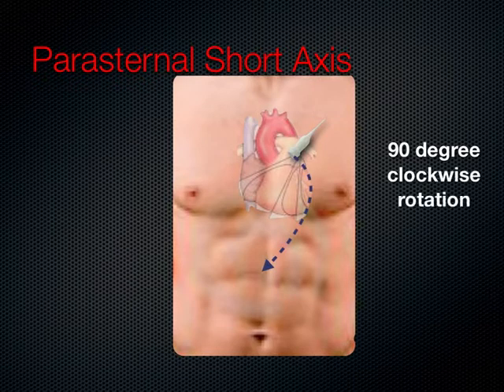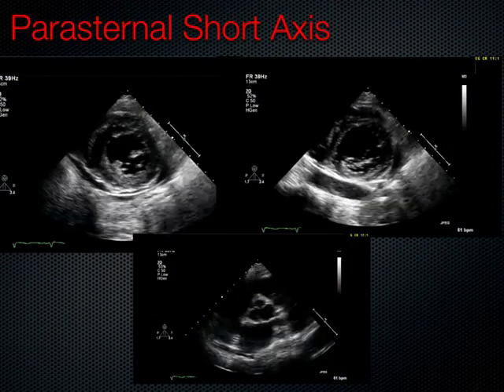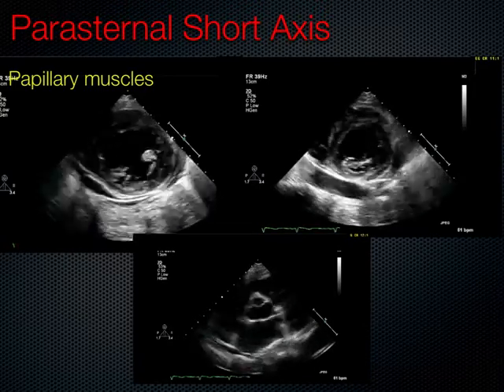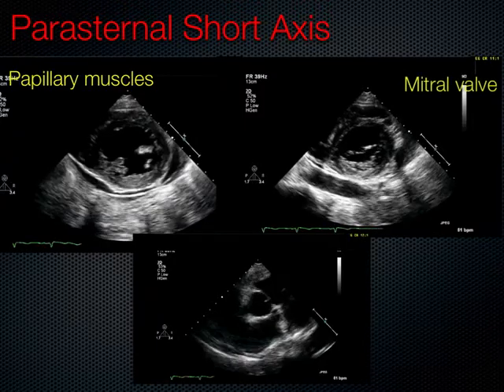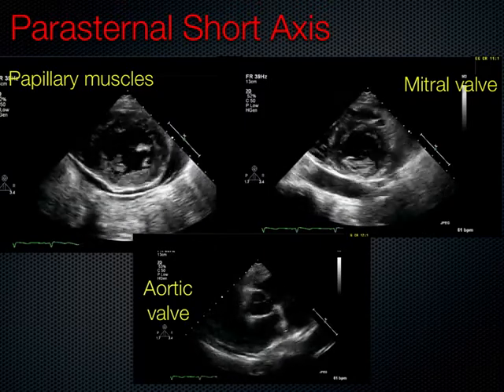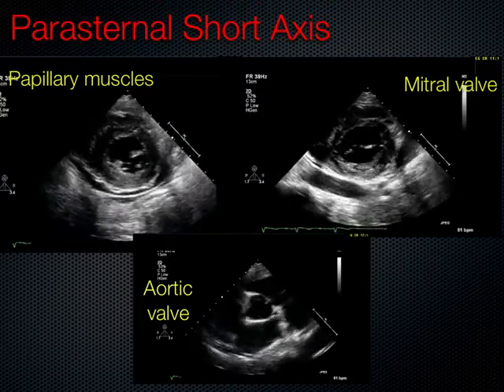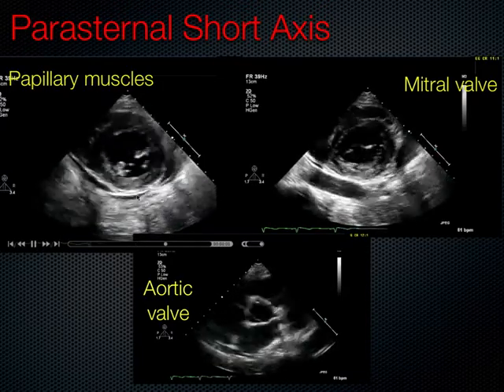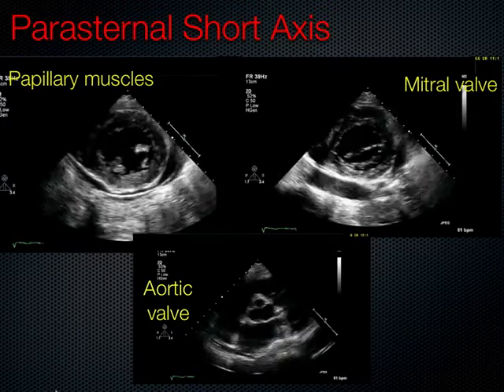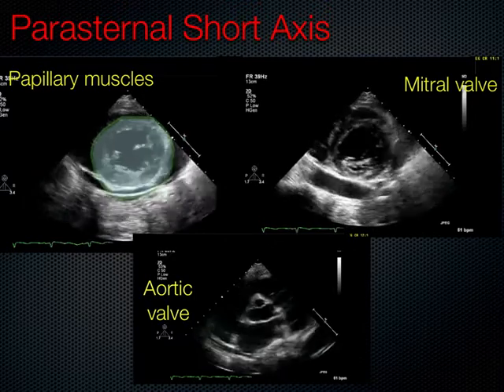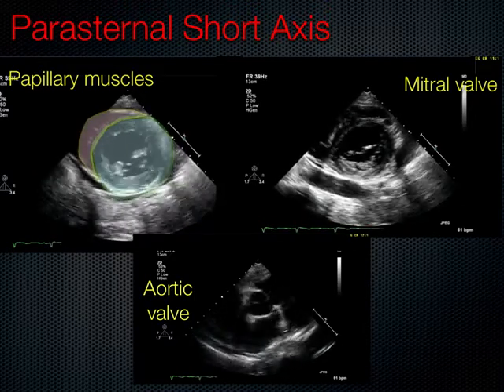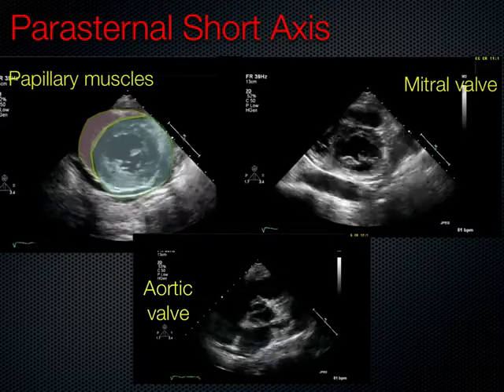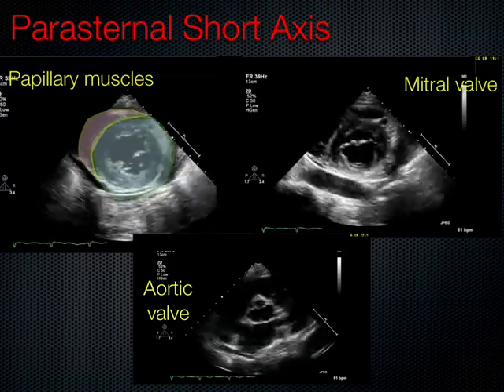Turning the probe from the parasternal long axis view 90 degrees clockwise, we can intersect the heart in its short axis and slice it like a loaf of bread, seeing the left ventricle at several different levels. The papillary muscle level is a cut near the apex. The mitral valve looks like a fish mouth, and the aortic valve shows the classic Mercedes sign assuming a tri-leaflet valve. In the short axis view, the left ventricle should appear circular like a donut with a small beret — the right ventricle — sitting atop. If the left ventricle does not appear circular, it often represents pathology.